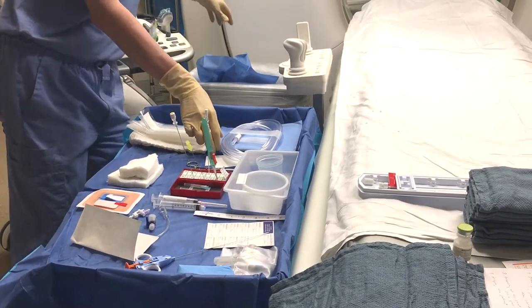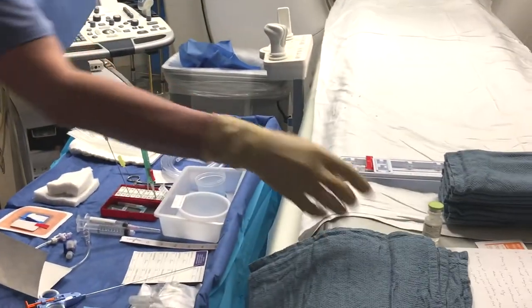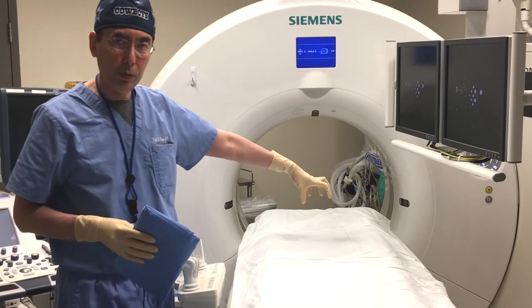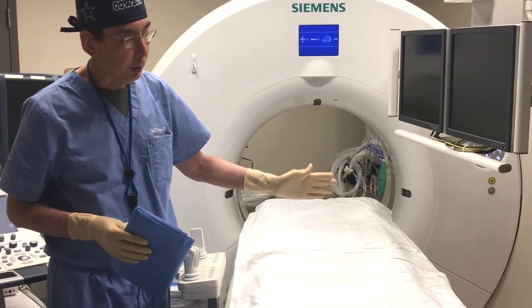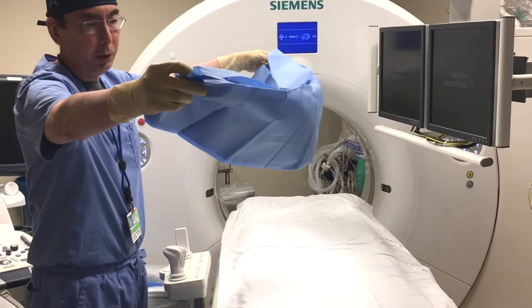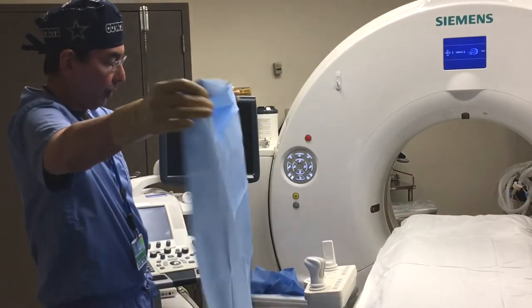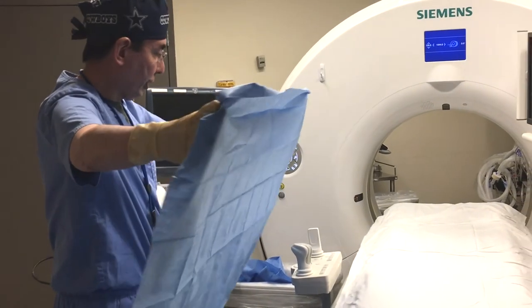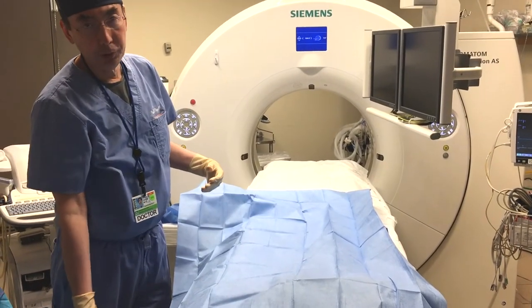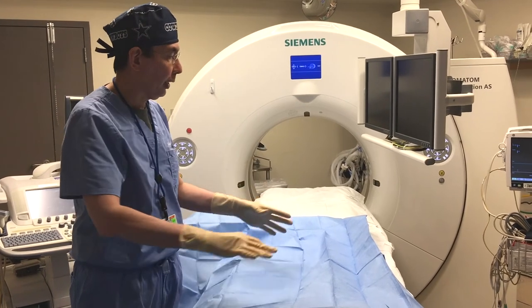We also have a half drape that's usually placed on the table. For a CT-guided procedure, the patient will be going in and out of the scanner. Even though you may have an eyelet drape on the patient's upper abdomen, the lower extremities will be passing you. To avoid contamination, open up one of these large half drapes and let it open in front of you, then lay it over the patient. This keeps you from contaminating your gown on the sheets covering the patient and covers the lower extremities as the patient goes in and out.